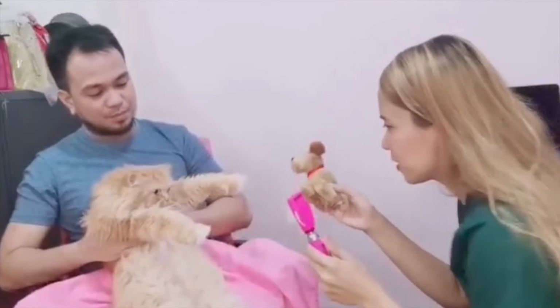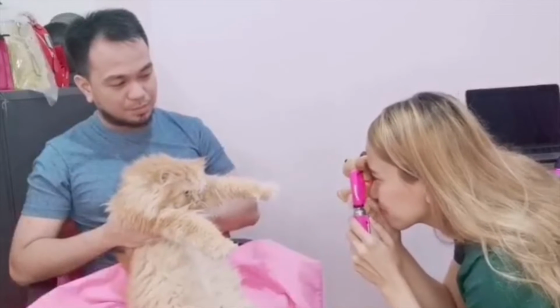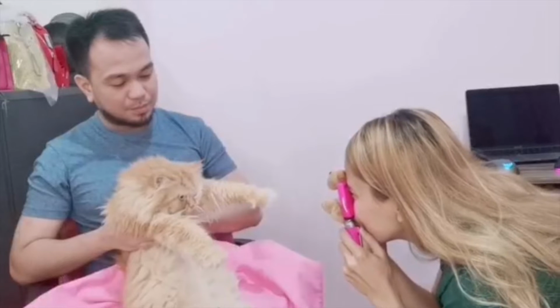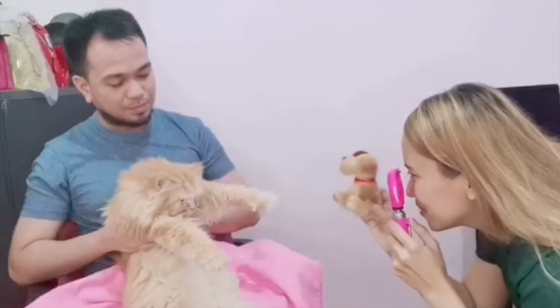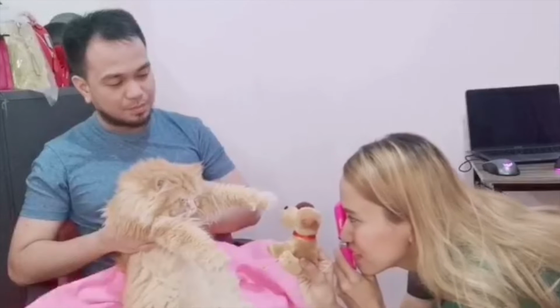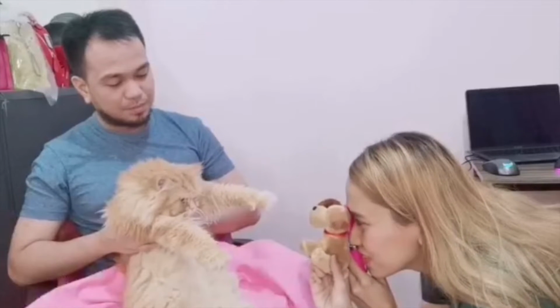Hold the ophthalmoscope in your right hand and approach the child's right eye from his right side using your right eye. From a distance of 20 cm, bring the red reflex into focus. Then come close to the child's head and adjust the lens until the retina comes into focus. Then examine the lens, disc, cup margins, vessels, and retinal surfaces, and look for abnormalities.